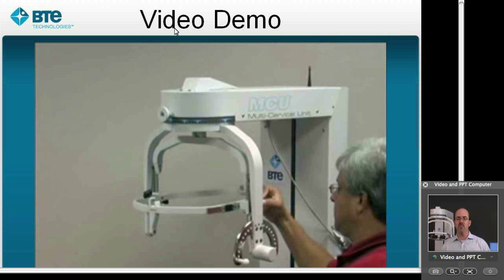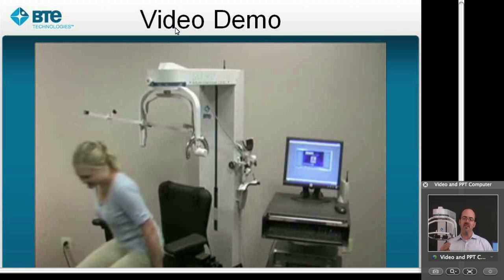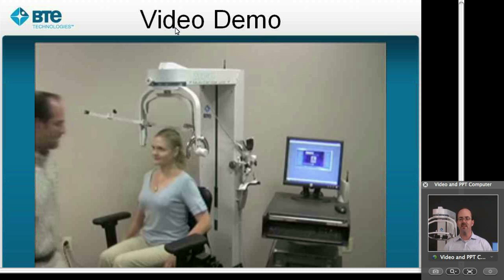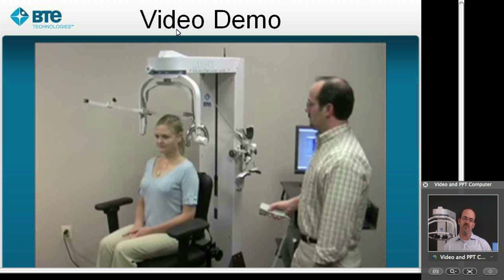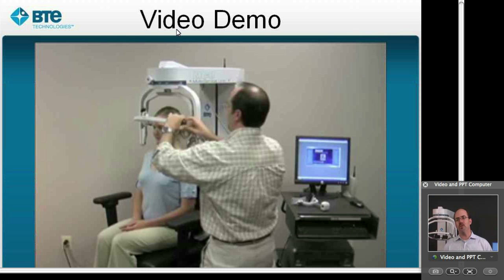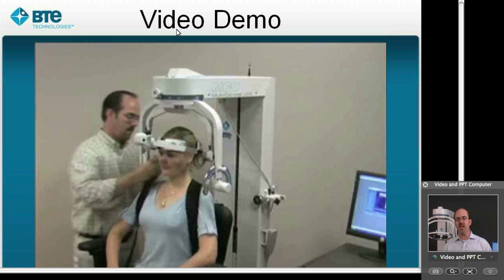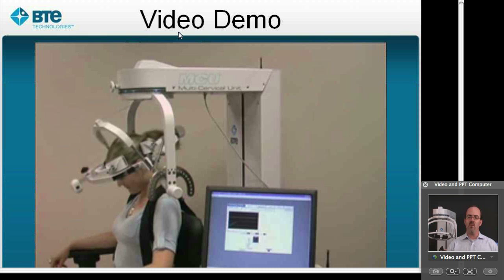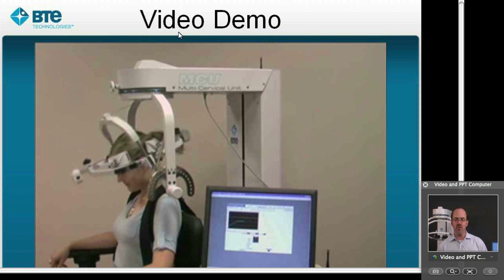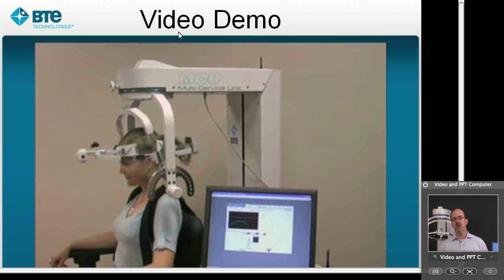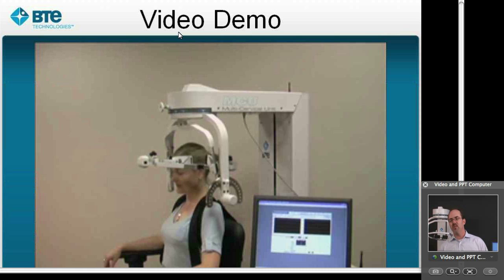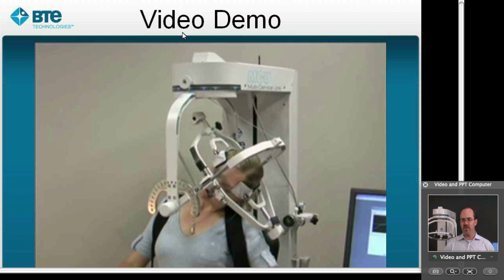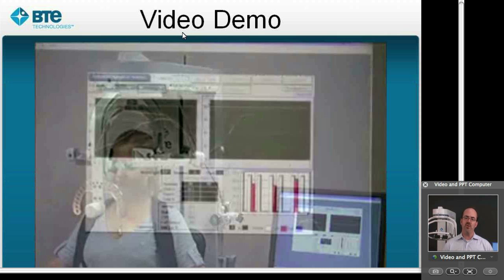It's also important to note that there are no motors driving this unit — it is only powered by the strength of the subject. So if there's any concern or anxiety about some motor moving somebody's head, I can assure you there are no motors in this. Here we're looking at range of motion in the lateral plane, lateral rotation, and lateral flexion. Throughout this, we're capturing data looking at both the velocity of movement as well as the range of motion over time.